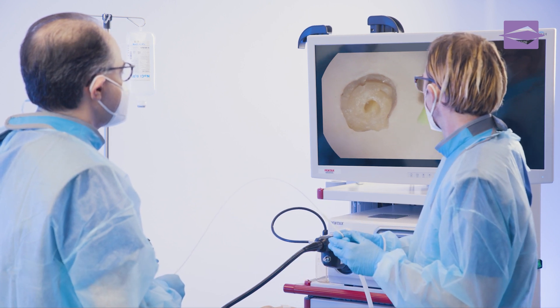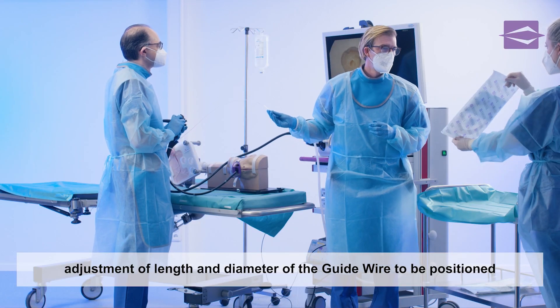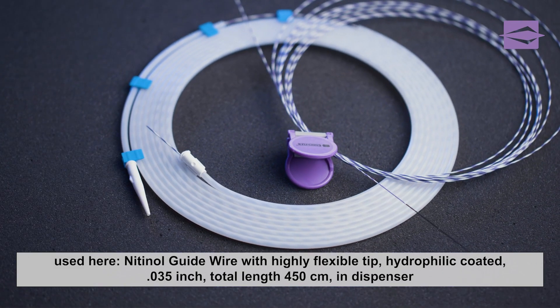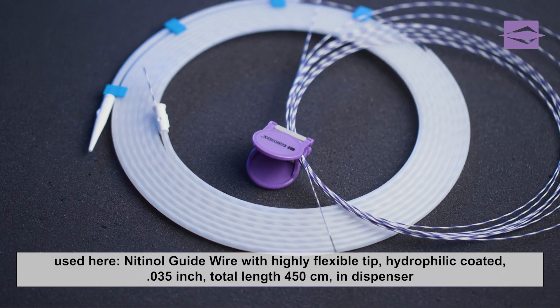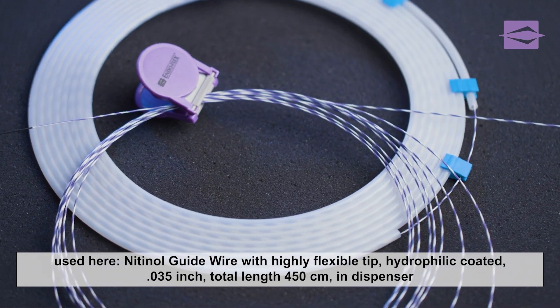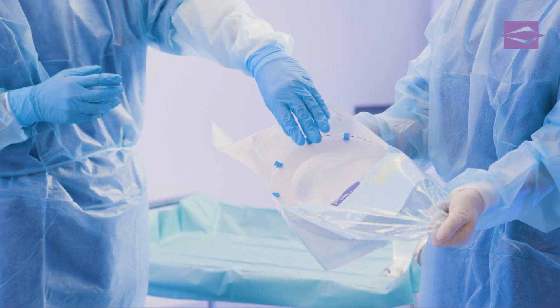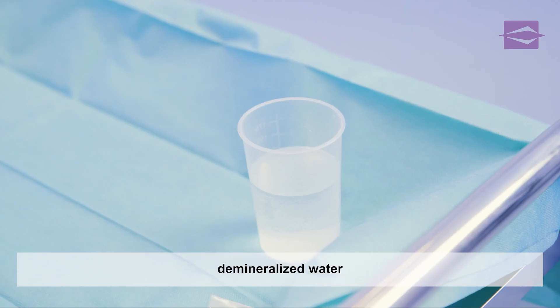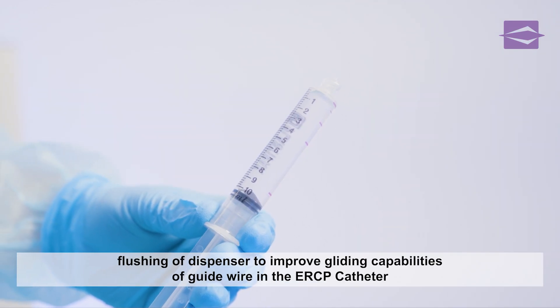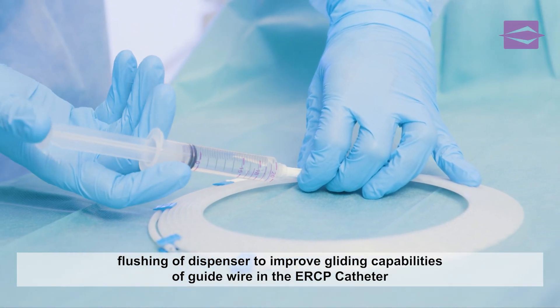For the upcoming probing of the bile duct, the assistant is handed a guide wire, for which the length, diameter and sterility expiry date are checked on the label. For this demonstration, a nitinol guide wire with a diameter of 0.035 inch and a total length of 450 cm, including a flexible hydrophilic tip, is being used, which is stored in a dispenser. After removing the dispenser equipped with guide wire from the sterile packaging, the assistant rinses it with demineralized water to significantly improve the gliding properties of the guide wire in an ERCP catheter.